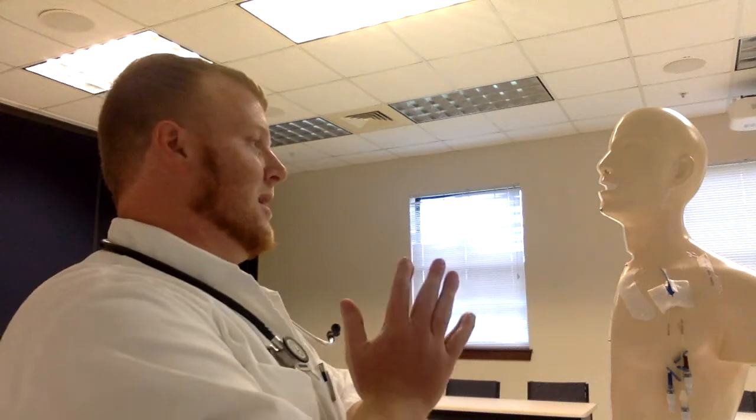One more thing before I get into the patient's room: dressing changes. The actual gauze dressing that's going to be on the outside is changed anywhere from 2 to 3 days. The clear dressing is roughly every 7 days, but if at any time the dressing looks soiled, is visibly loose, or looks like it just needs to be changed, then we're going to go ahead and change it, because we really want to prevent any kind of infection. It's like a barrier in a sense, so we want to make sure that it's sealed at all times.